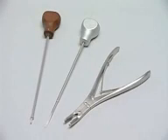Misplaced pedicle screws may cause neurological injury and will compromise the biomechanical integrity of the construct. The instruments for safe insertion are the pedicle awl, the pedicle probe, and the rongeur.